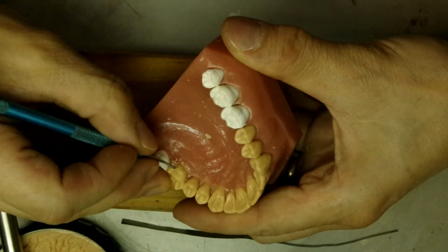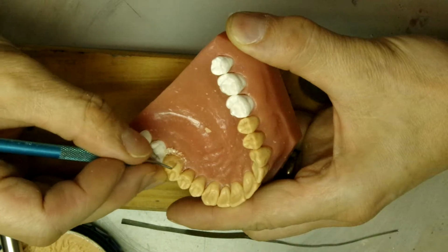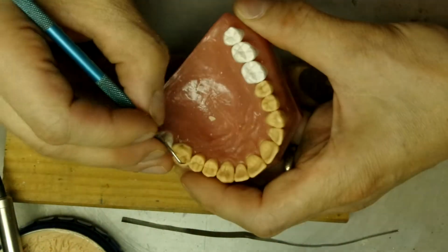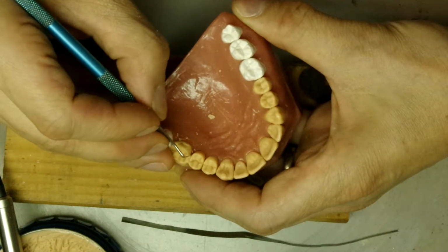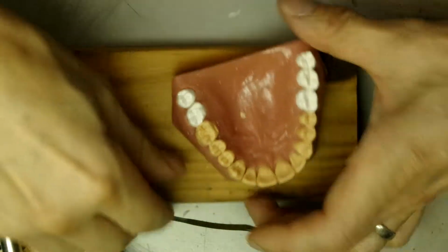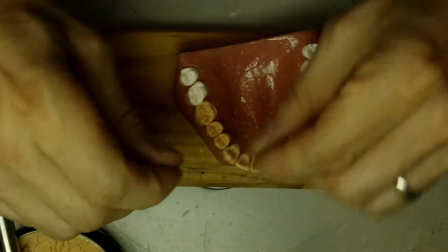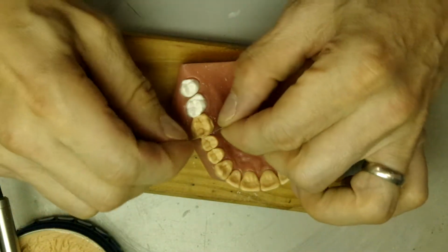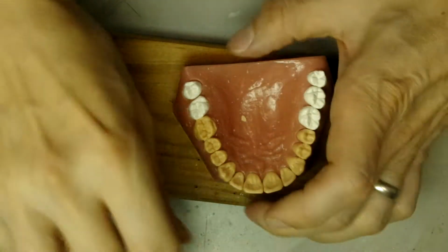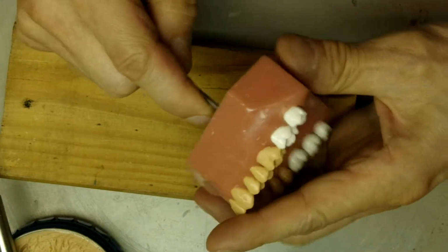Now just take off some of the excess. Divide this up a little bit. And what we'll do is we'll take this saw, and we're going to saw right through the interproximal so that we can pop it out and fix the margins.